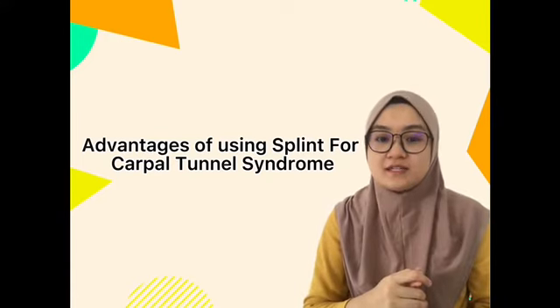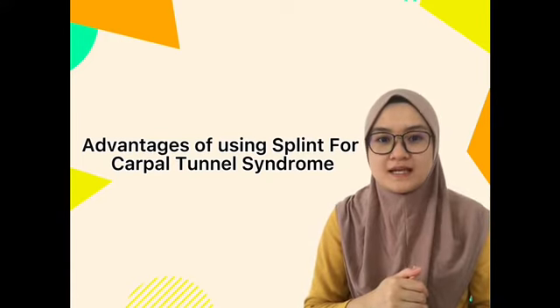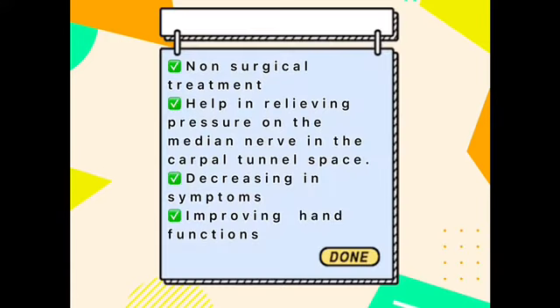These are the advantages of using a splint for carpal tunnel syndrome. It's a non-surgical treatment, helps in relieving pressure on the median nerve in the carpal tunnel space, decreases symptoms, and improves hand function.